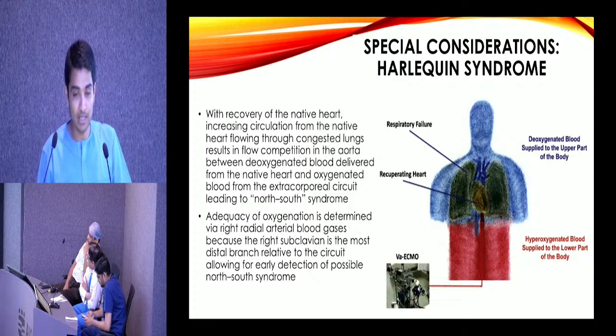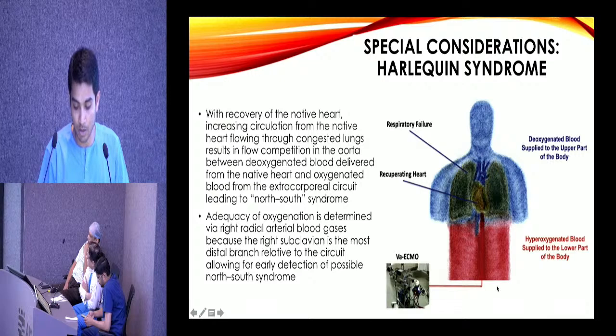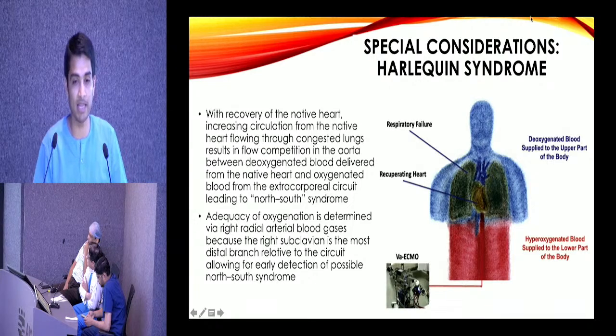If the left ventricle doesn't recover, all you have is oxygenated blood coming from the ECMO, and that goes from the aorta. It supplies the entire lower half of the body, but because of the pressure, it will flow upwards and supply the upper part.